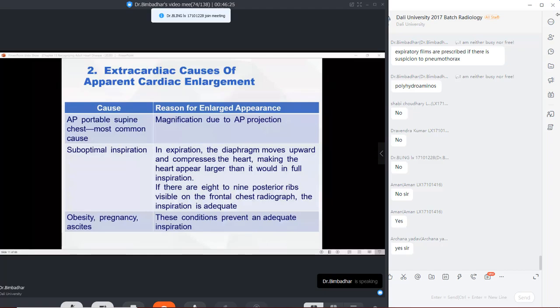Okay. Such a condition will also increase the size of the uterus, but the real size of the fetus is small. Still, everything present down in the uterus is pushing the intestines, and the intestines thereby push the diaphragm further, and the diaphragm thereby compresses the heart, which will cause the heart to not expand, and it will look like a cardiac enlargement. Is this clear now? Okay.